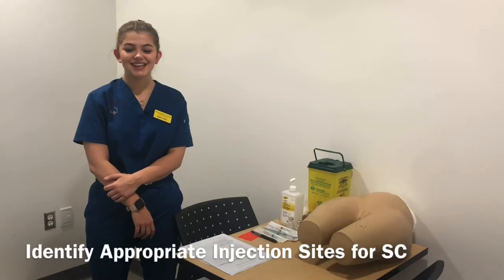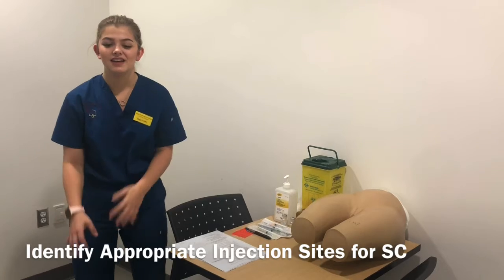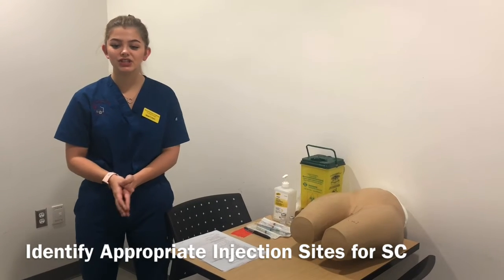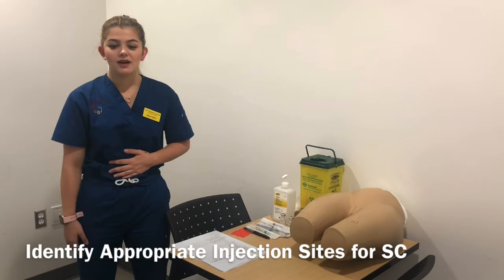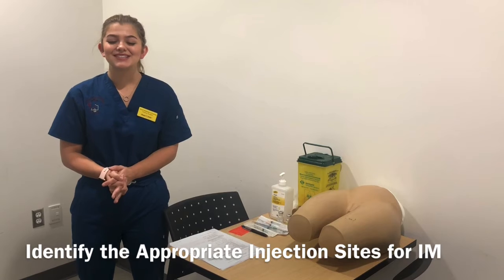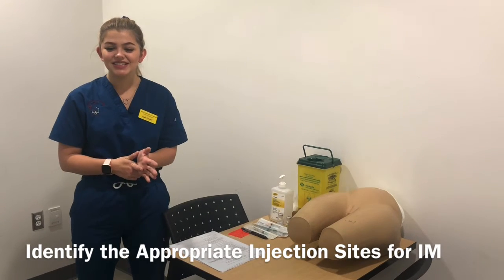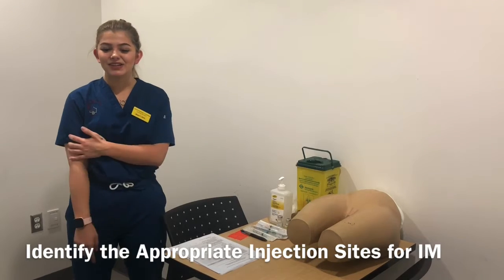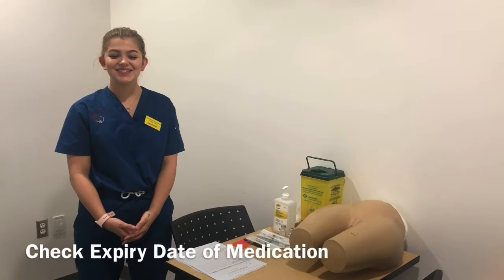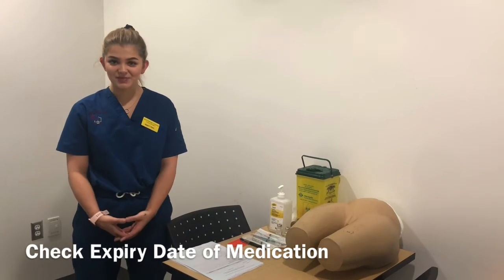These injections get injected into the abdomen, the outer aspect of your arm, and the anterior aspects of your thighs. But today I will be administering the subcutaneous injection into the abdomen. The IM injection can be administered into the vastus lateralis, the dorsal gluteal, and also into the deltoid. Today I'll be administering it into the deltoid. So I'm going to check the expiry date on the medication as well to ensure it's not expired.